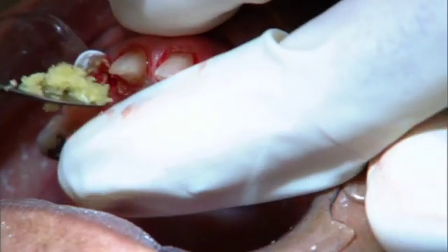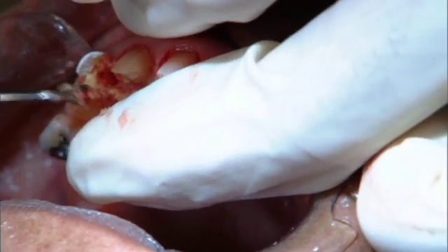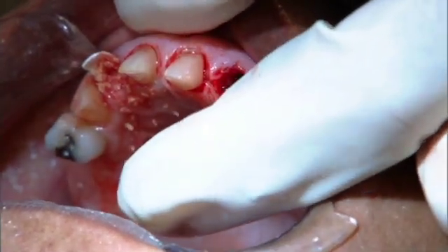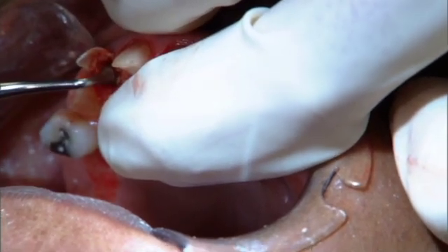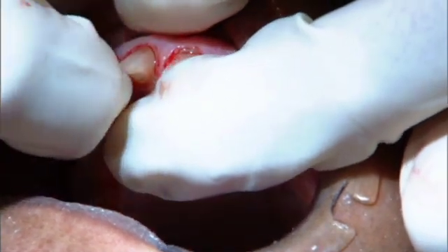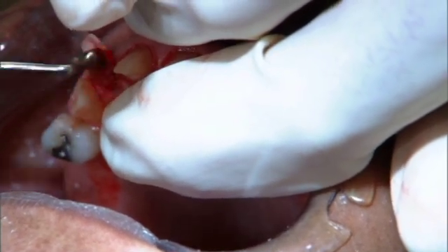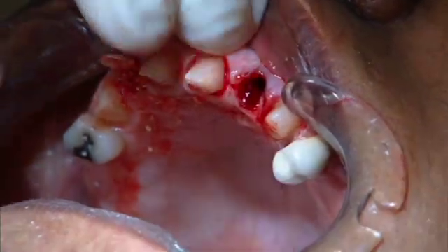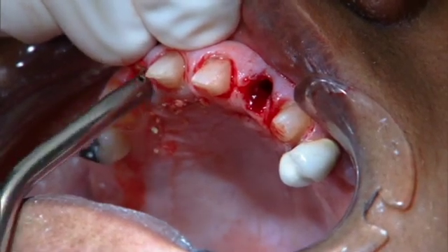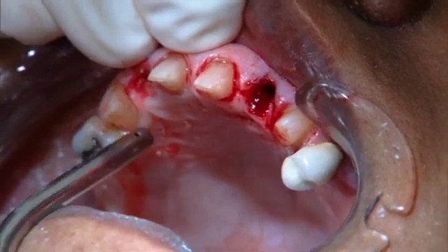You'll notice Kathy's not using her suction so she doesn't suck up all of the graft material. And I'm not going to fill this socket hole completely because I want to give that pontic enough room to help us generate some nice soft tissue and for it to exert a little bit of force on the graft for us. Kathy, if you'll hand me the suction, then what I'll do is I'll take out enough of this graft material to provide that space, and kind of clean any other graft material around the preps.